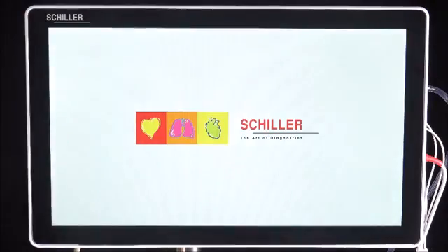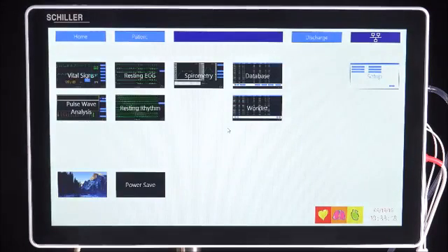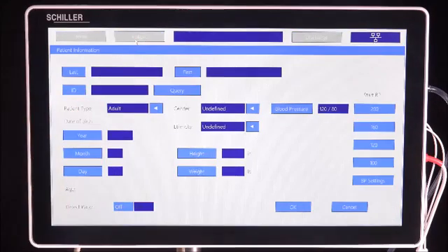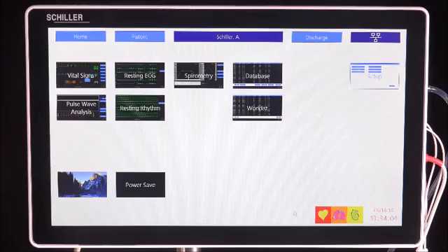To switch the unit on, press the on button on the top left side of the unit. The home screen is the first screen displayed once the unit has been switched on. To input the patient information, press Patient. Once all the demographics are filled out, press OK to be redirected back to the main screen.